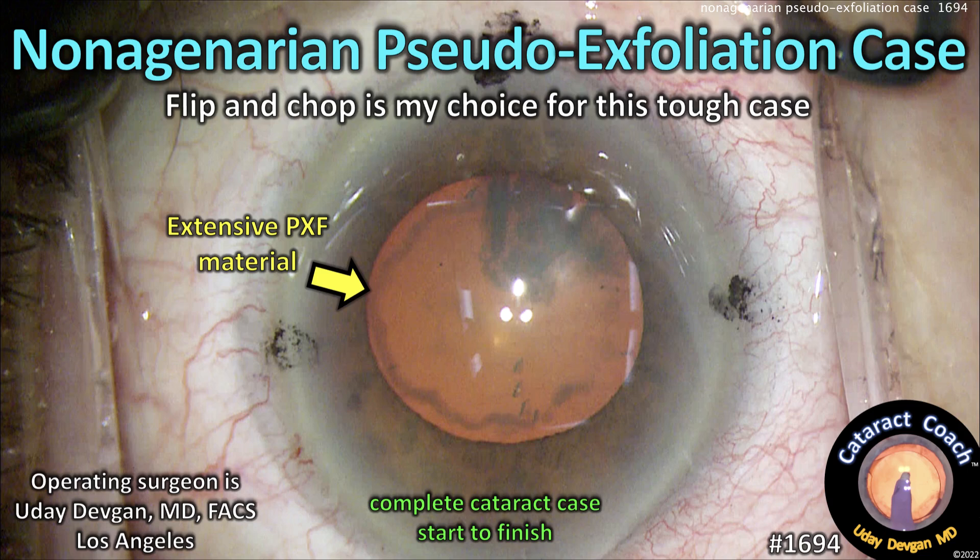CataractCoach.com — a nonagenarian with pseudoexfoliation. Flip and chop is my choice for this tough case.